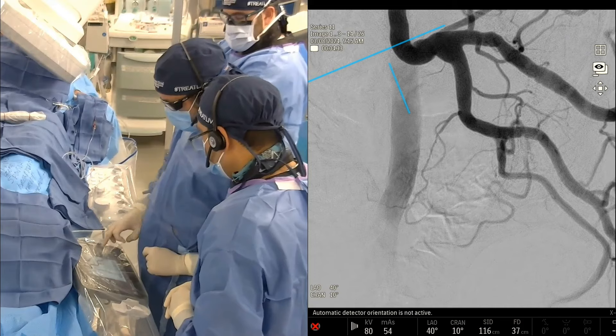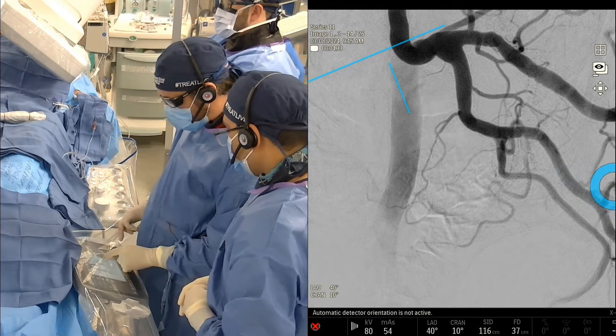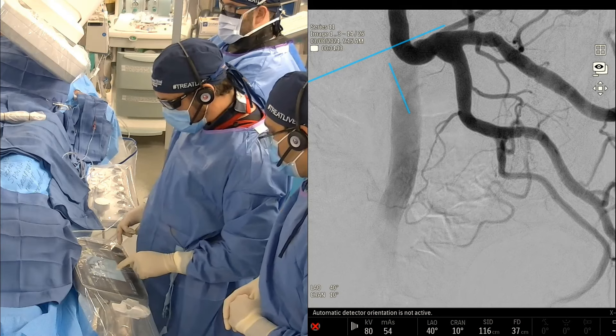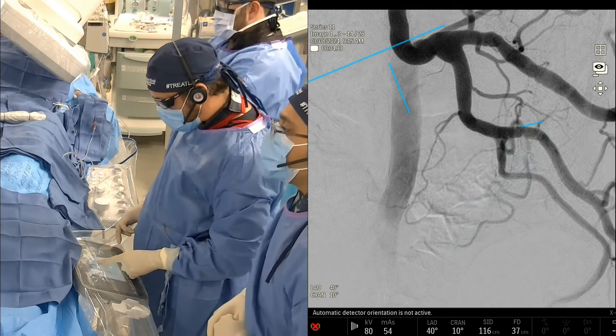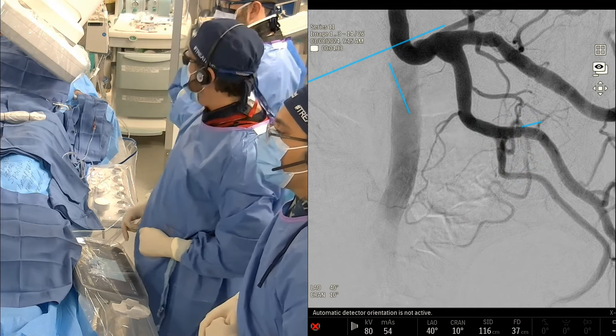We don't see the obturator. As we come down, we see the inferior glute here, and we see the pudendal. If you look closely, it looks like the prostate artery — which is this vessel here — we're going to trace it all the way back: it originates off the side of the pudendal, which is right here. At least that's what I think based on this image.